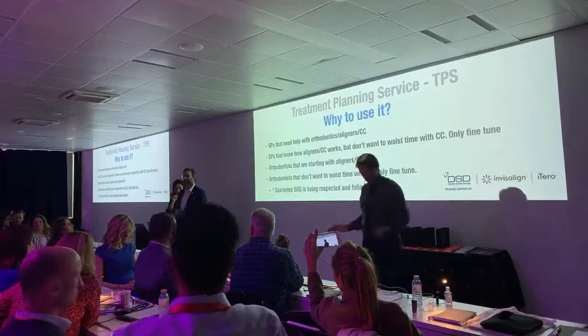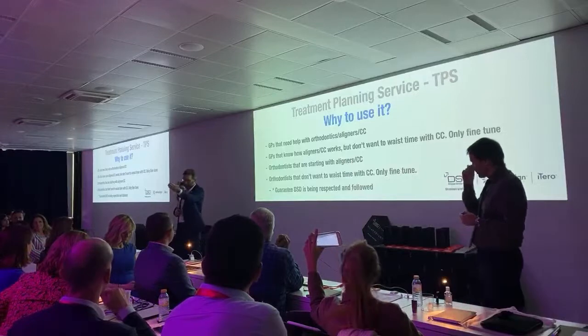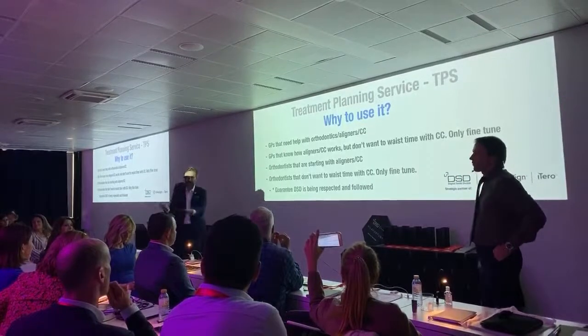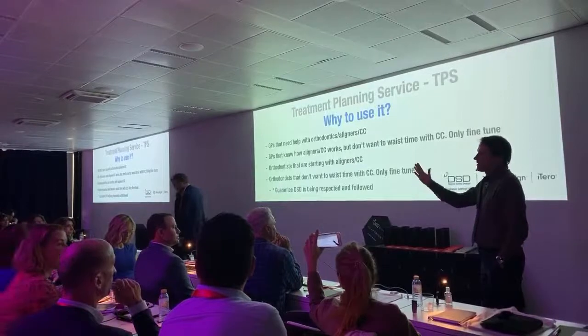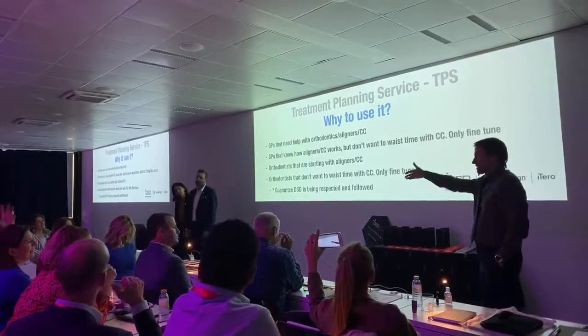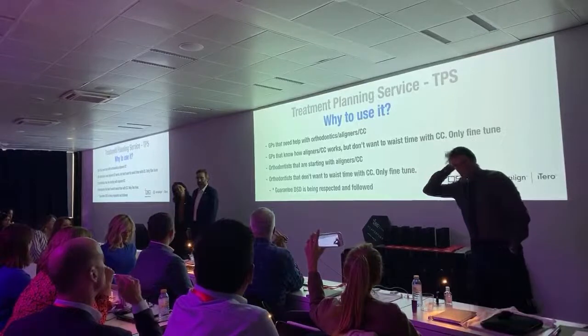If you think the chance of the patient not accepting ortho is very small, this is an option. I would go for a ClinCheck anyway, because ClinCheck is very powerful to sell and to explain. Of course, Itero has an ortho simulator, the outcome simulator, but it's not the same. You learn how to present ortho with the DSD overlap, and we understand the story, right? So, Francis, just a question.